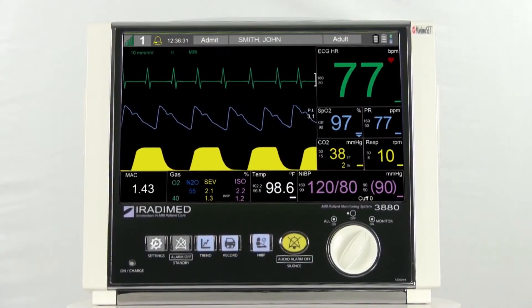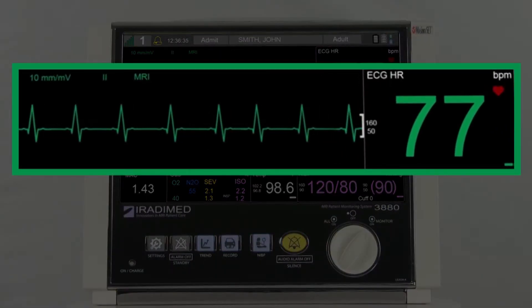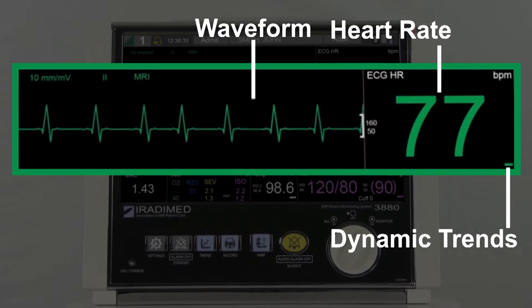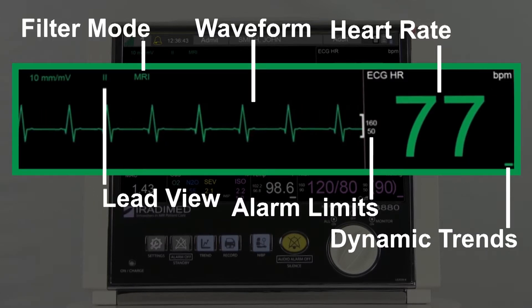The ECG readings will be displayed in the green section of the patient monitor. Here the user will see the heart rate, dynamic trends, the waveform, alarm limits, filter mode, lead view, and finally scale.